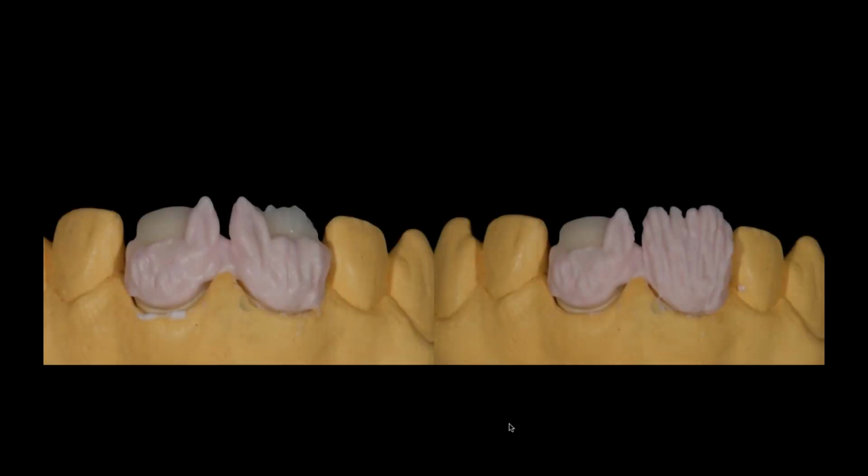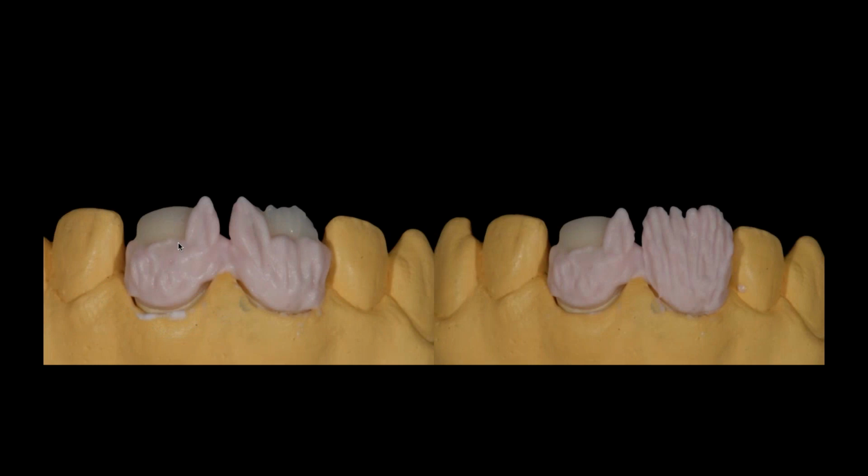Now let's go back to a normal buildup. I'm going to build the 2 units now with 1 dentin. I'm going to use A1 dentin or 1M1 dentin, whichever one you want. They're similar, not exactly the same, but similar. And I'm going to build it with just 1 dentin. But remember, the adjacent tooth next to it, I'm basically building that whole tooth with 1 dentin or A1 dentin, which means I'm going to have about 1 millimeter of dentin on that tooth.